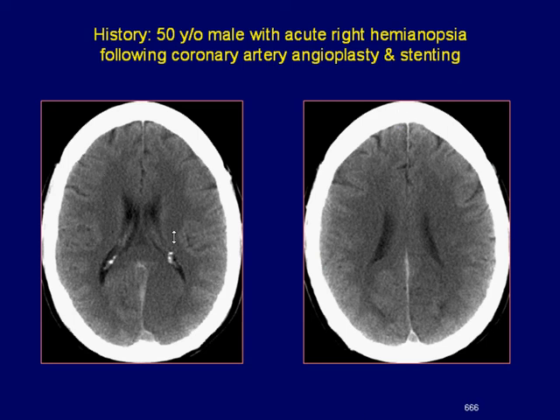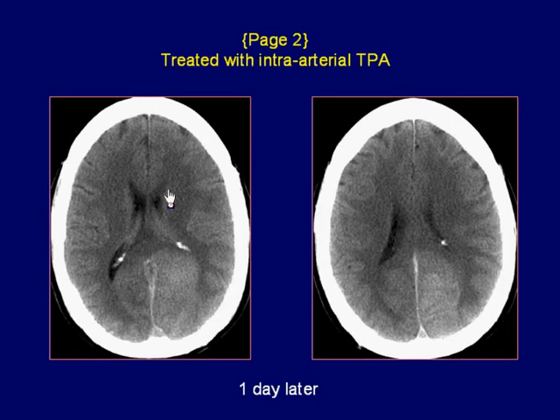Non-contrast CT demonstrates loss of gray-white matter junction in the left occipital lobe with associated mass effect, consistent with acute infarct. CT examination non-contrast one day later after treatment with intra-arterial TPA demonstrates increased mass effect in the left occipital lobe with associated hyperdensity.